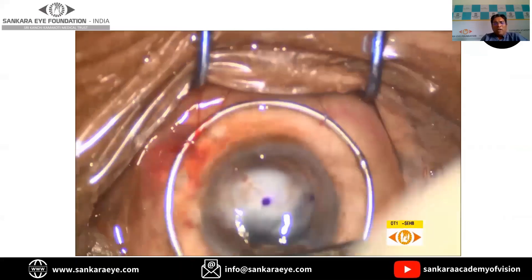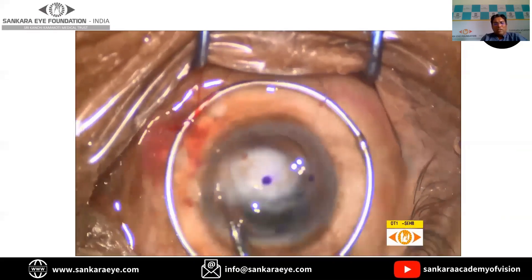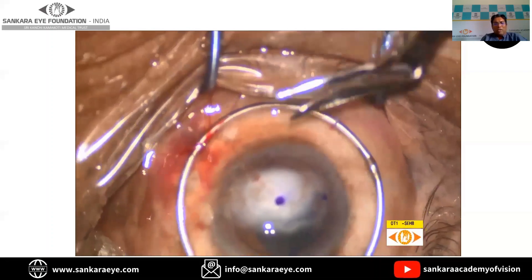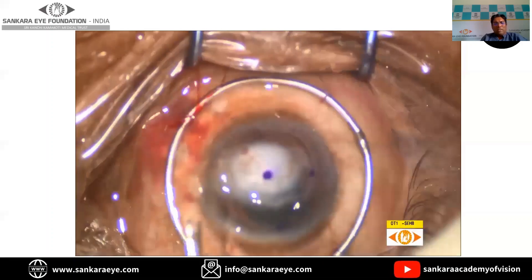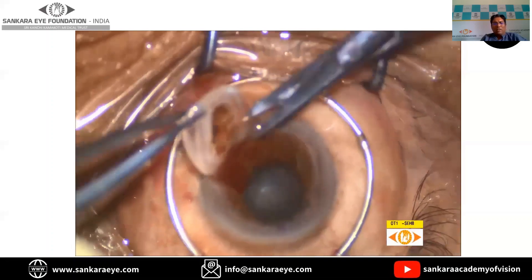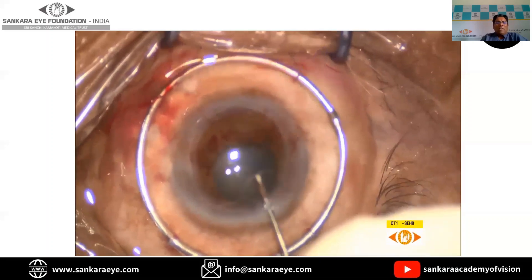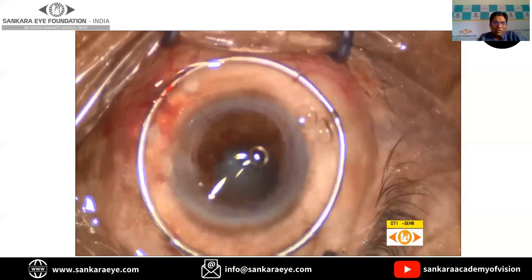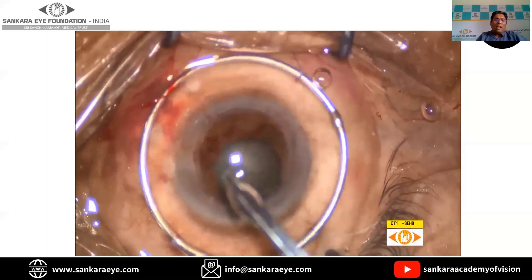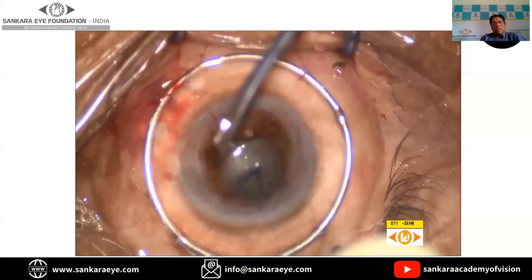Once we do a partial trephine, we do a guarded entry and then the button is cut in a circular fashion, making sure that the intraocular structures are not damaged. In this particular case, there is a coexisting cataract, so cataract surgery has to be done in a routine fashion. Many times biometry can be an issue in these situations, so the ideal way is to use the axial length of the involved eye and the keratometry of the other eye in calculating the IOL power.